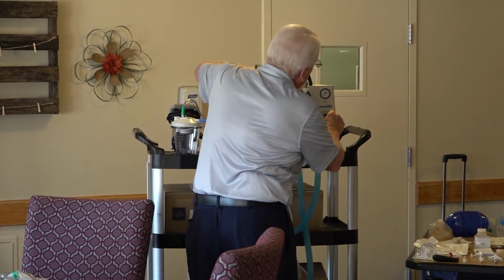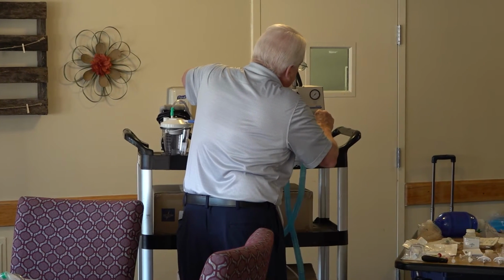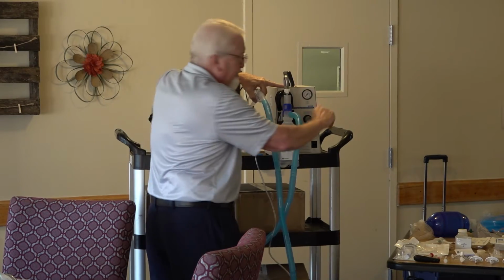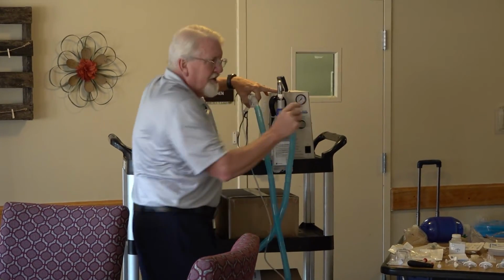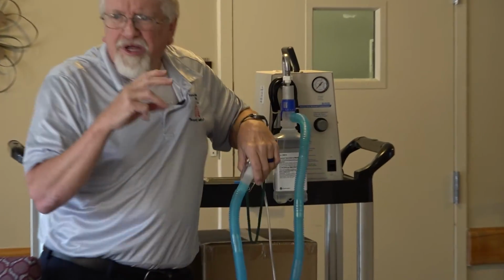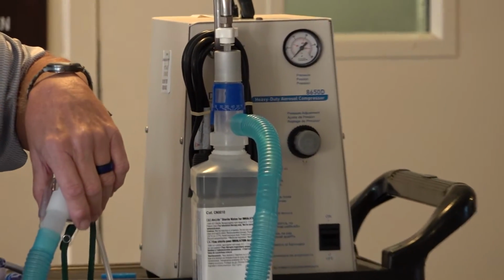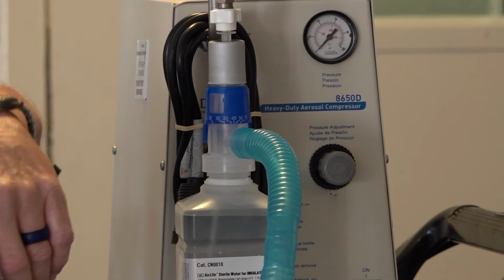And so the biggest thing that I like to remind folks of is when you're trying to adjust it, on most of them, just turning that dial is not doing anything, and you'll notice that, and don't get frustrated because nothing's happening.